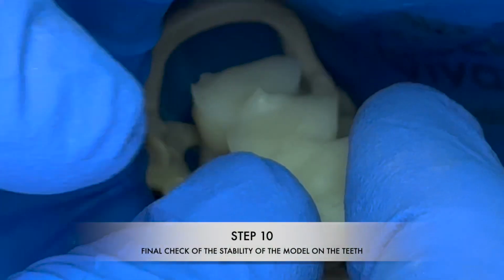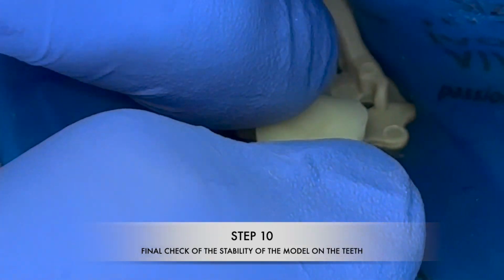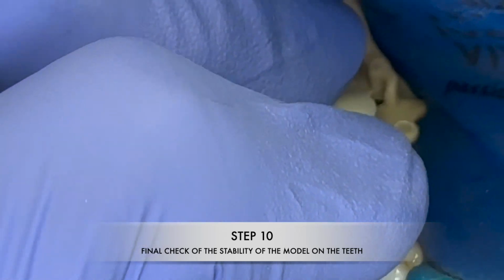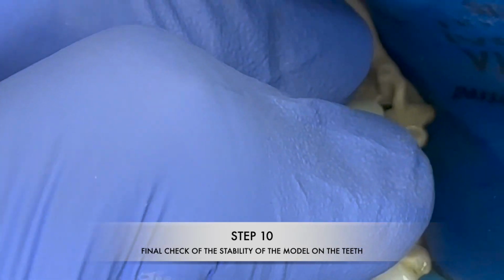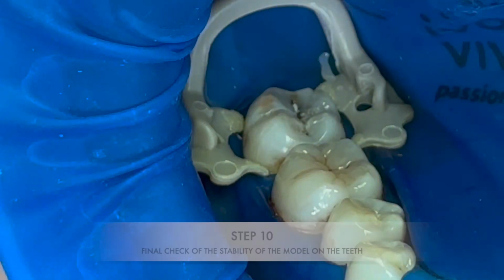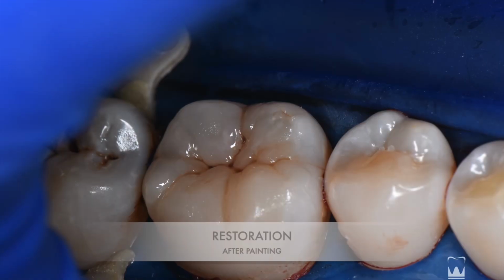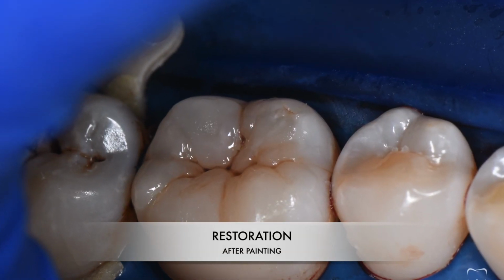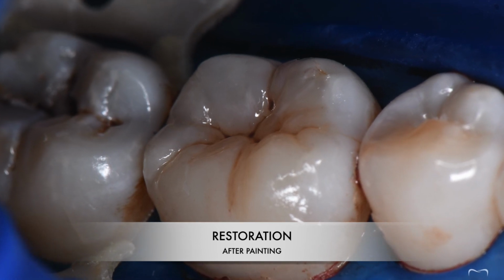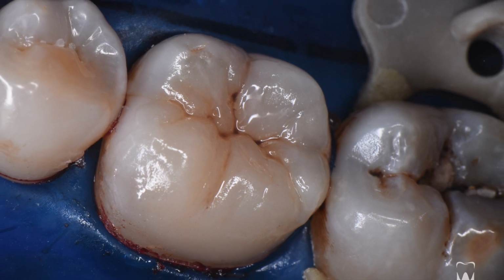Step 10 is the final check of the stability of the model. If the model is located on the teeth exactly, without play and mobility, then you did everything right. If there is mobility and play, this is a reason to carry out a correction before removing the rubber dam and clamps. As a result, we get the ideal morphology right away, and it does not need to be ground to obtain an accurate occlusion. It just needs to be polished.